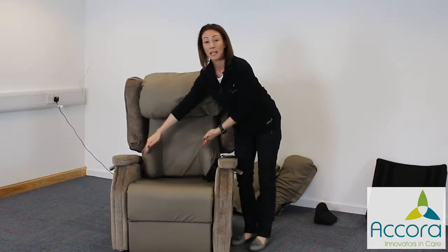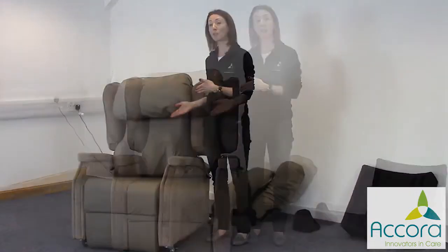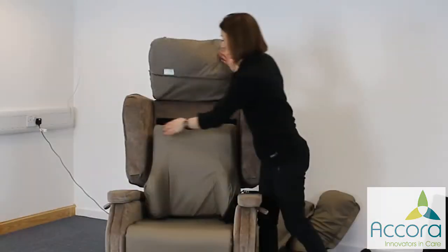As you can see here, we have additional support by the pelvis to provide that stability, and that in itself can enable a person to obtain and maintain a good upright position. However, they may need support in other areas, and so we would remove this and put in place an adjustable lateral support backrest.